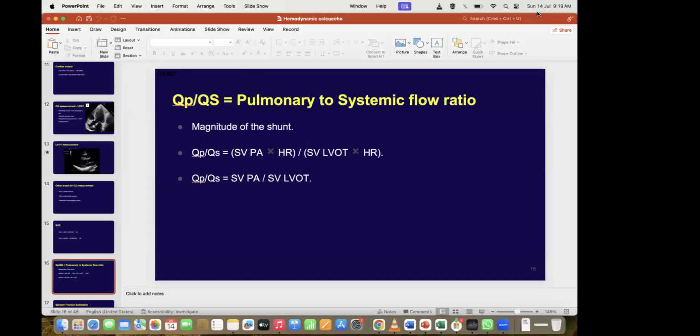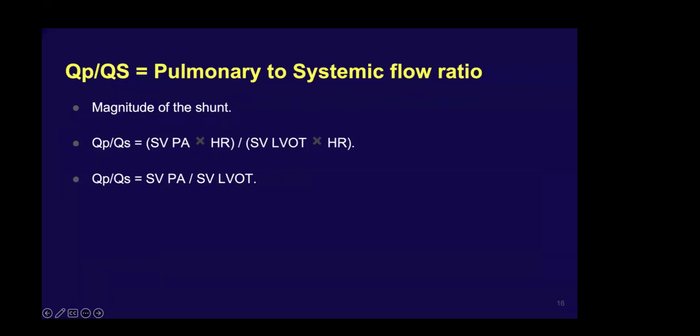Yes. LVOT VTI has already been discussed. It has got a lot of uses. Can anybody sum up where else we can use LVOT VTI? LVOT VTI per se is used in cardiac output also. Most importantly, in ICU, we can use VTI variation, instead of PPV or SVV, to detect fluid responsiveness. If it is more than 20%, it indicates that the patient is hypovolemic.